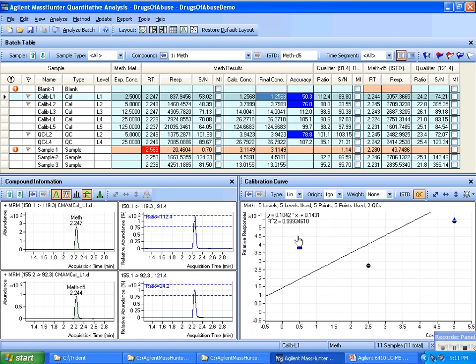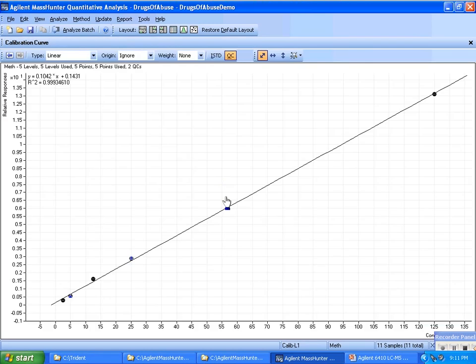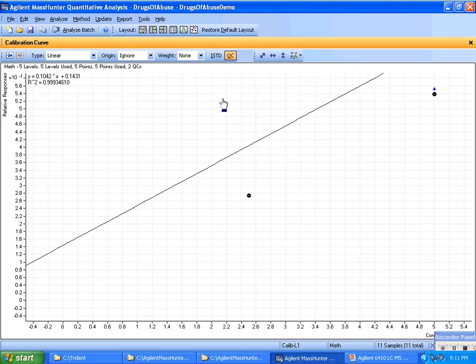Now, I look down at my calibration CurveFit. The R-squared value is decent. Let me zoom in to take a better look at that. Now, I've got a linear ignore with no weighting. And what I've got is a problem at the lower level, fitting the curve to the points. I can see that better if I zoom in on those levels.